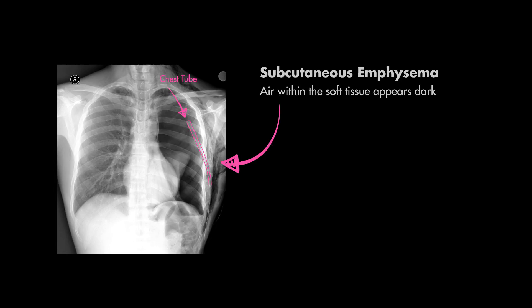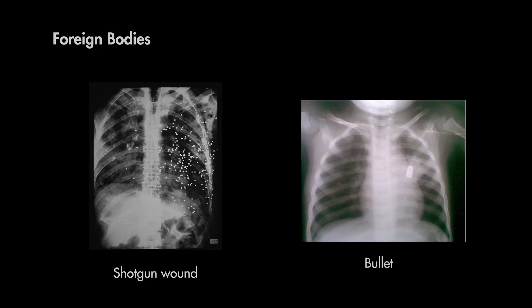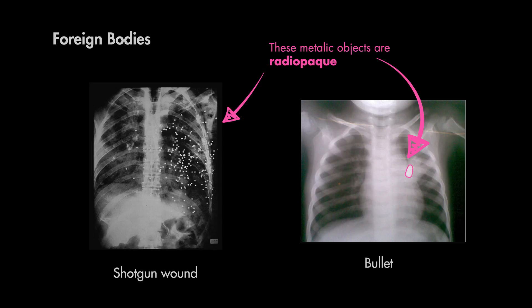You could also get this finding after trauma in patients with pneumothoraces. Here's another x-ray with soft tissue abnormality — in this case a foreign body. These little pebbles you see here are from a shotgun shell to the patient's chest. And here's another gunshot wound. Notice that these metallic objects show up as dense materials in contrast to the underlying soft tissue, which should tip you off that these objects don't fit in this film, suggesting a foreign body.